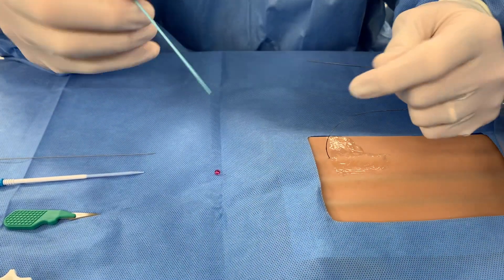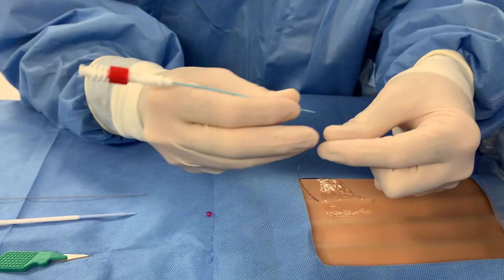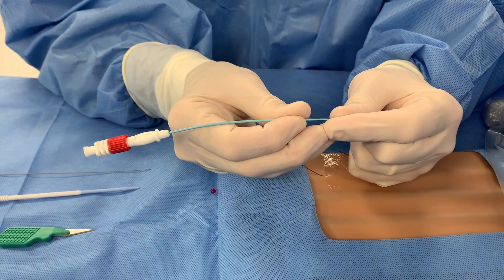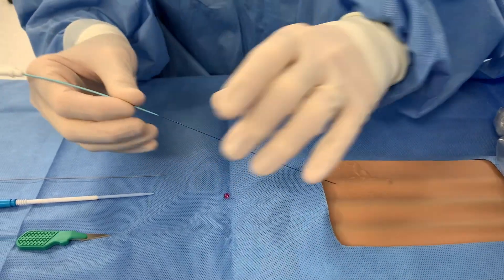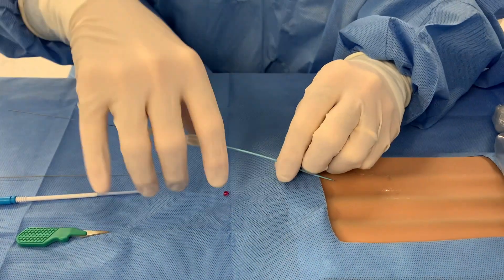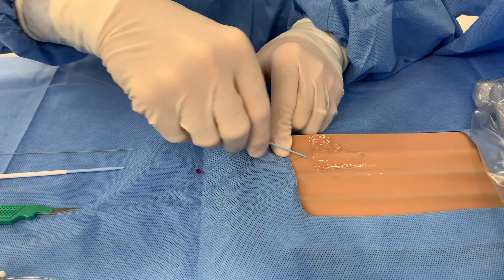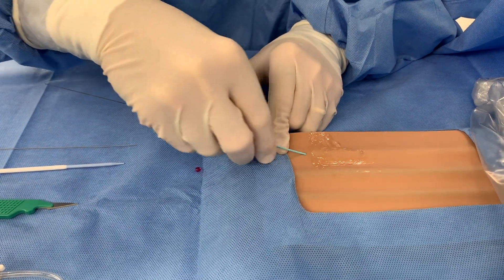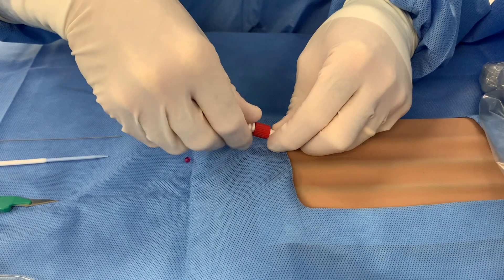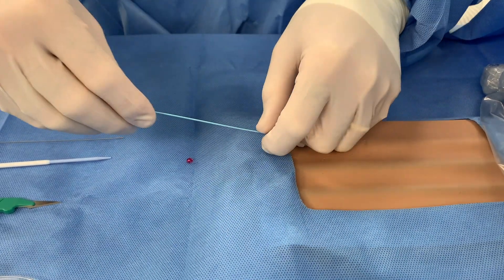Advance the micropuncture introducer catheter and coaxial dilator over the guide wire and into the vessel while applying gentle skin traction. Remove the dilator and guide wire, leaving the introducer catheter in place.